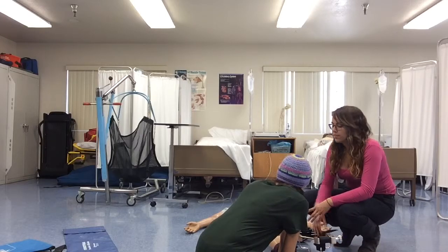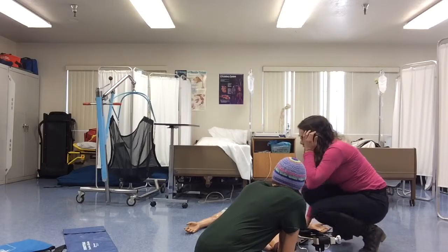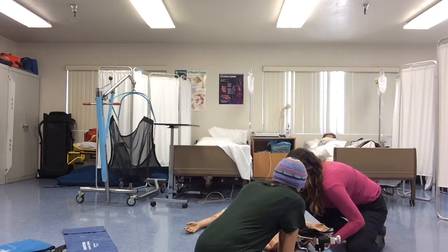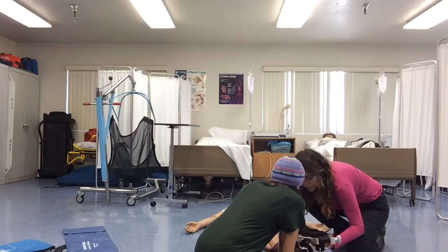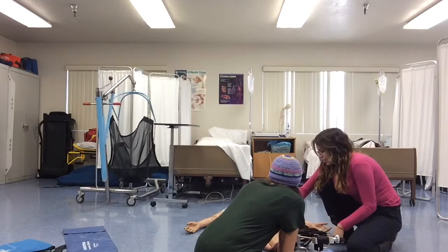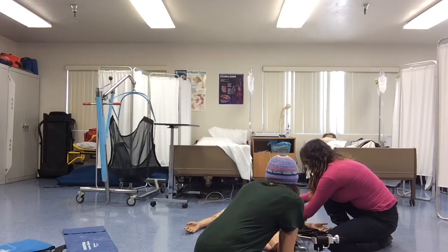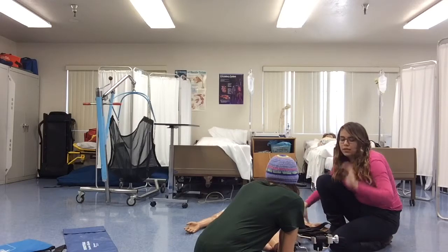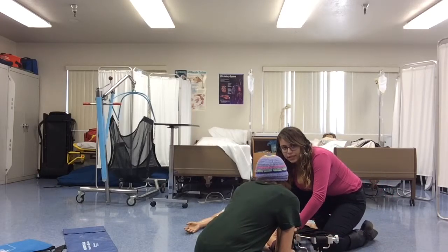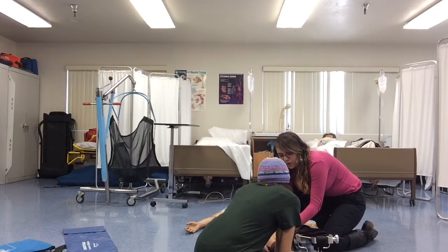And I'm going to move the straps around so they're in the right locations. One should be above the femur injury, one above the knee, one below the knee, and then one for the ankle. So I'm going to make sure all my flex straps are open. I'm going to locate my groin strap. Okay. So now I'm going to support my patient's thigh, and at the count of 3, we're going to place the traction under the splint. So 1, 2, 3.